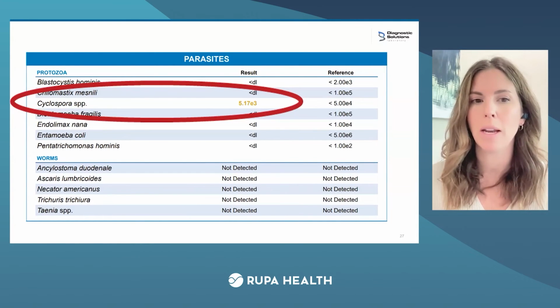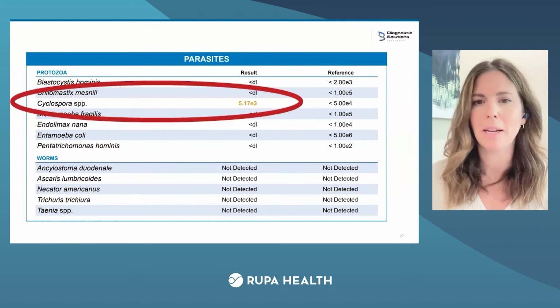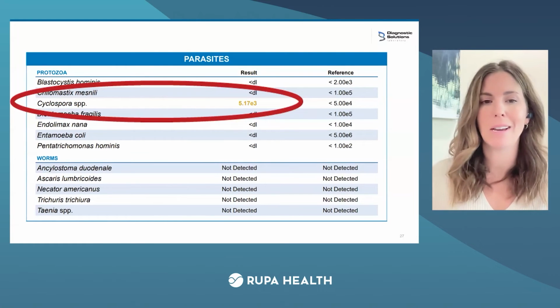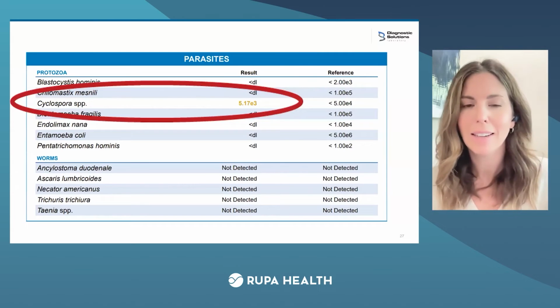But you'll remember on page 1, we also had Giardia. So here we've got 2 protozoa. And that to me is really significant. So by itself, not significant. Paired with Giardia and the 3 bacterial infections and Candida, yeah, we've got a lot to deal with here, and I take this a bit more seriously.